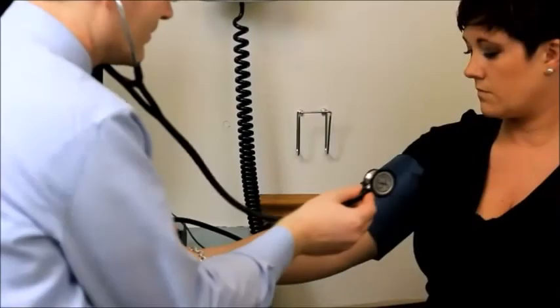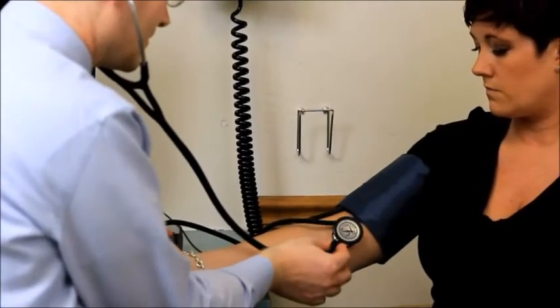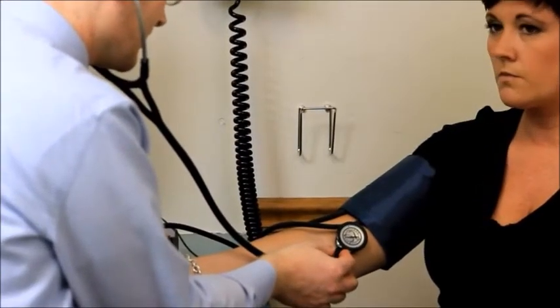The stethoscope used should have tubing long enough to allow the clinician to view the manometer while listening to Korotkoff sounds.